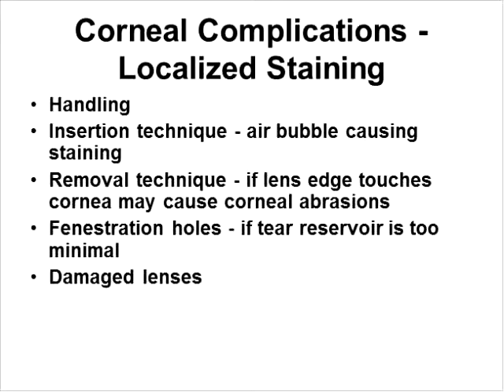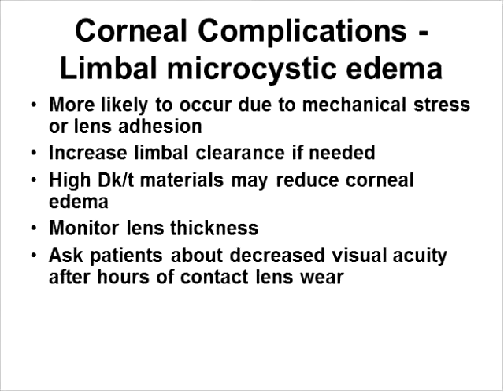If localized staining is seen, it could be due to a handling issue, an insertion technique where an air bubble is causing the staining, or if a patient is having trouble removing the lens, if the lens edge touches the cornea, it may cause a corneal abrasion. Fenestration holes can also cause localized staining, and of course damaged lenses.